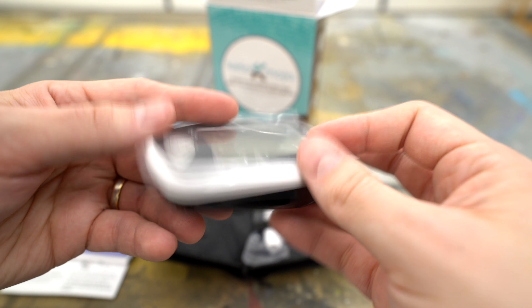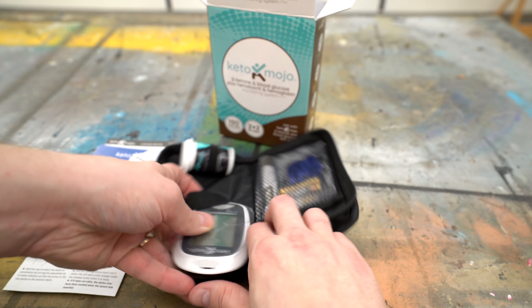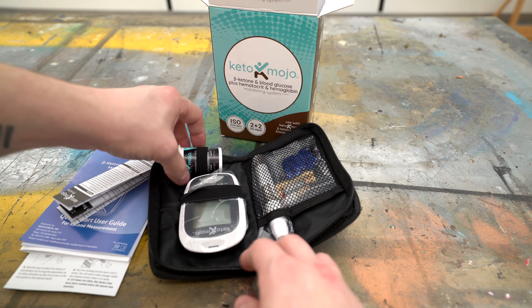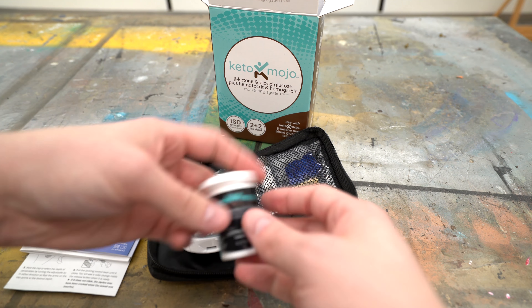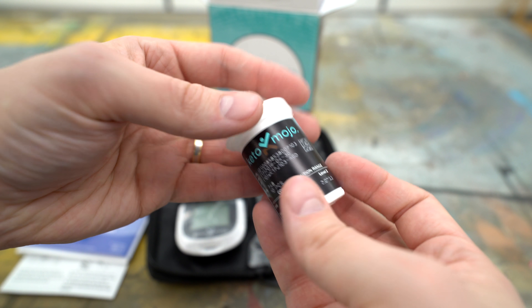And then also the monitor itself. The first thing I noticed with the monitor is it feels pretty sturdy and it seems like a medical device — it doesn't seem like a toy or something cheaply made. It actually feels like a good quality medical device. The package I got also included the ketone strips, because that's a big part of making sure that I'm in ketosis and hitting my nutritional goals for the ketogenic diet.